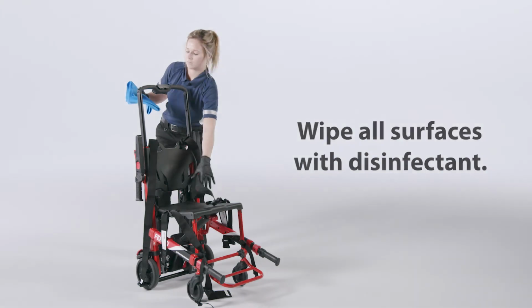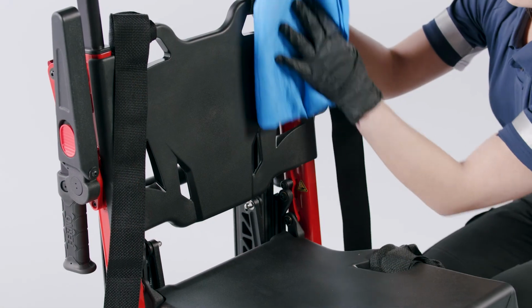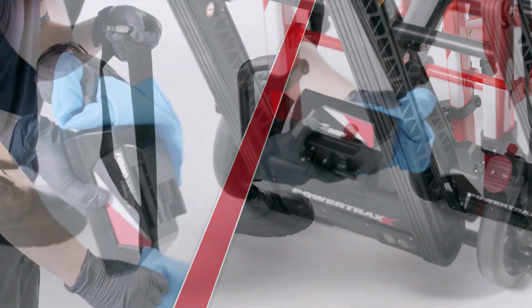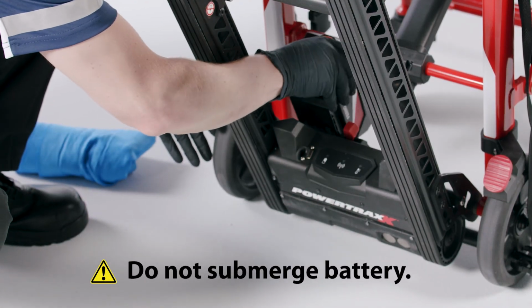To disinfect the Transcend chair, wipe all surfaces with disinfectant. Follow the disinfectant manufacturer's instructions for application method and contact time. Remove the restraints and battery if applicable to properly disinfect the components. The battery is water resistant but should not be submerged in liquids.